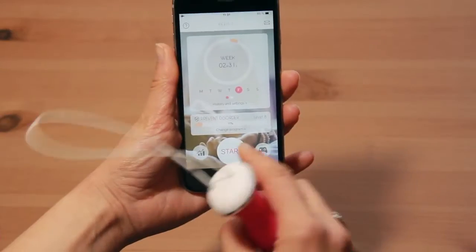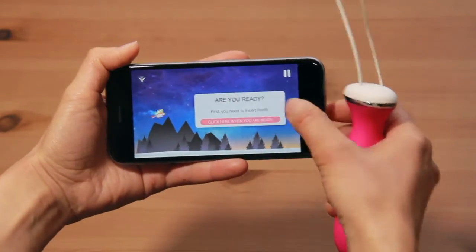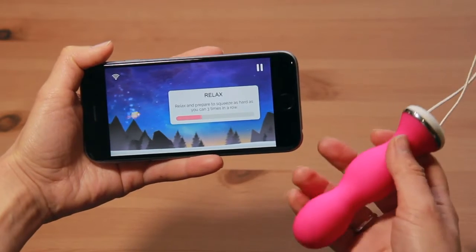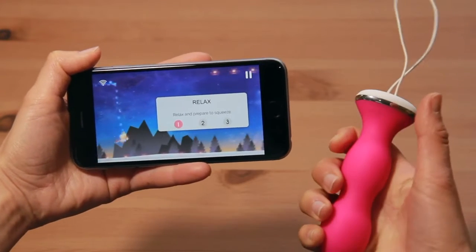For this first game, the aim is to catch the lotus flower and avoid the birds. Every lotus you catch gives you a point, and the goal is to score as many points as possible. To make pelvic floor rehabilitation more engaging and fun, the Parafeet application allows you to play games by controlling the contractions of your perineum.